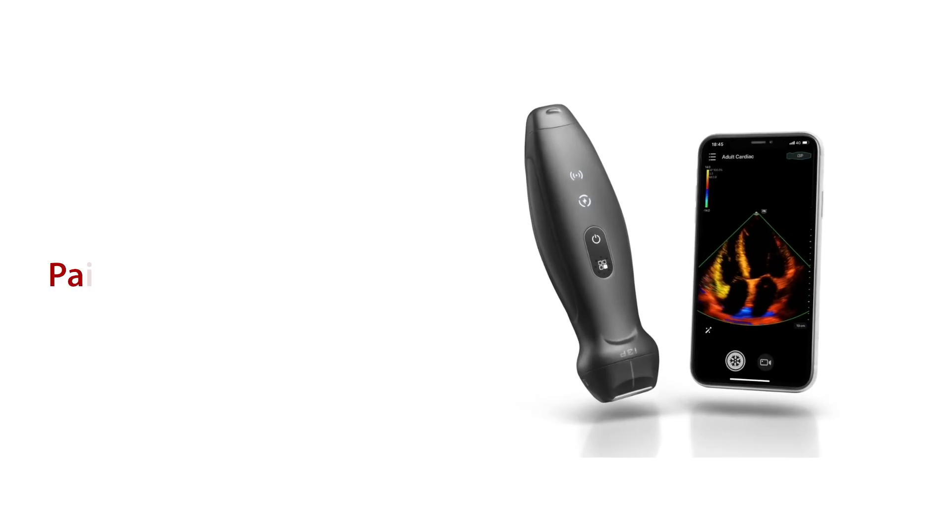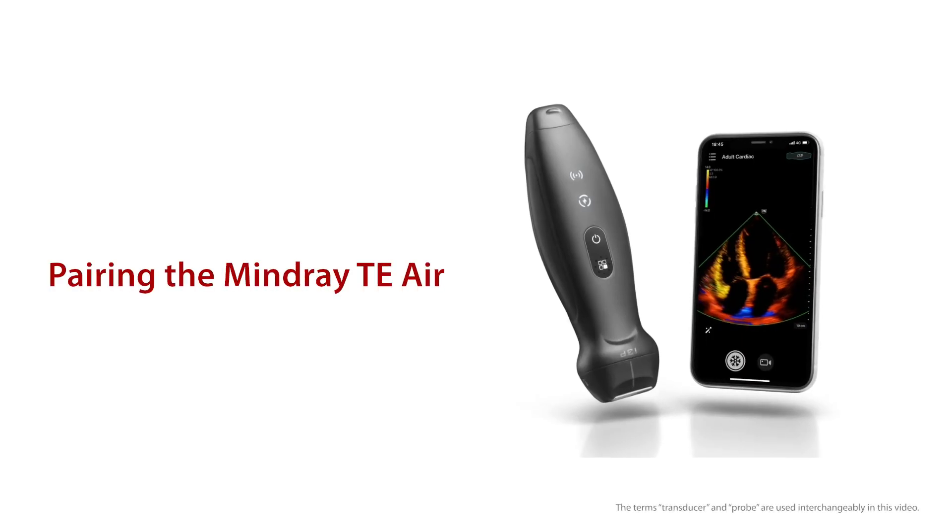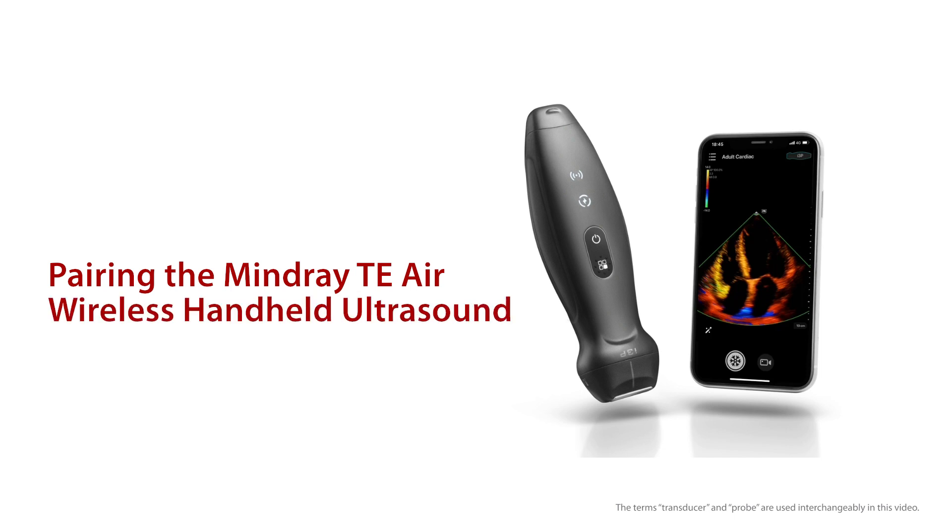In this video, I will demonstrate how to pair the MindRay TE Air Ultrasound system with a wireless transducer and connect additional transducers after the initial pairing.